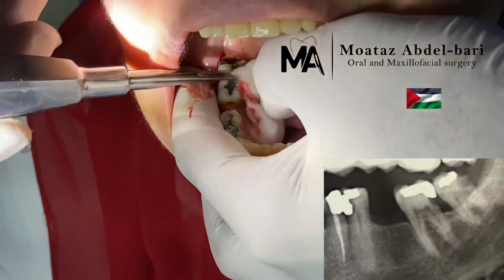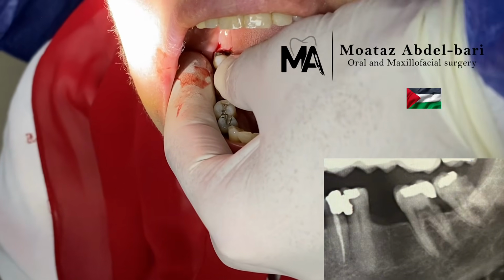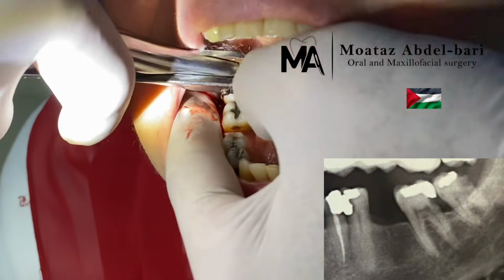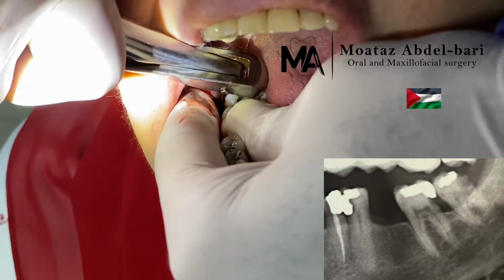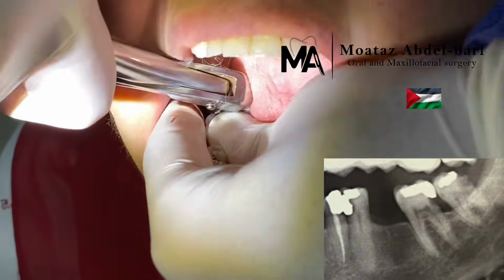I try with little help, no progression in this case, so I shift my mind from the extraction of this tooth to gaining as much luxation as possible. You have to change your mind at this moment if you feel any resistance to gaining any luxation.